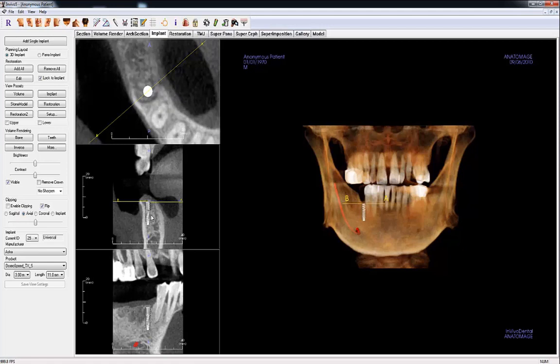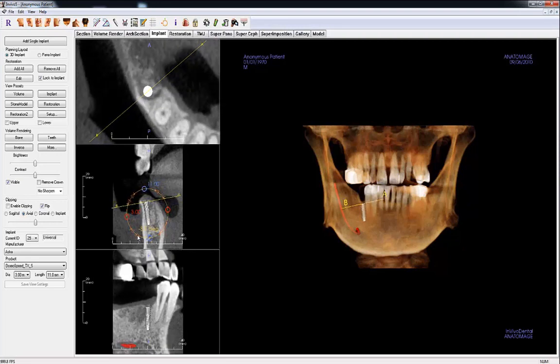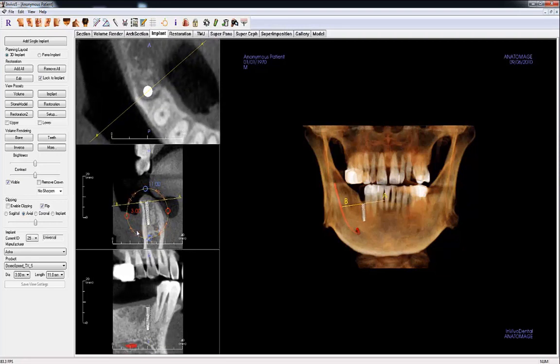With the implant selected in the cross-sections, a widget will appear to adjust the implant. You can rotate the implant with similar orange rotational arrows. There are additional red and blue circles that can be used to adjust the diameter and length of the implant. You can delete an implant by ensuring the implant is selected and pressing the Delete key.